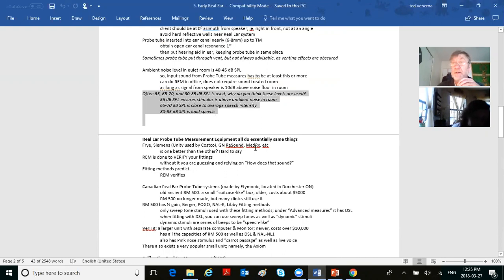Today's real ear, we don't do REUR, we threw it out. And secondly, in today's real ear, we use 3 different inputs because hearing aids today use compression. So that completes our discussion on yesterday's real ear. Next week, our Zoom session will begin coverage of how we do real ear today. But if you don't know what happened yesterday, you don't know why you're doing what you do today. It's always good to take history. I am a big believer in history.